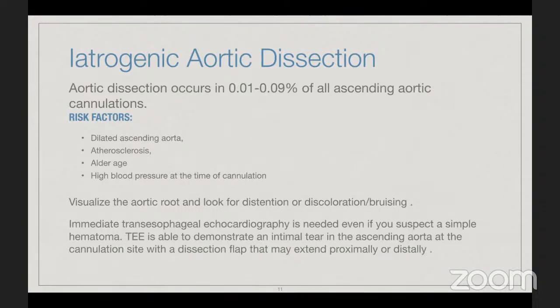And can't I continue the bypass with a low flow after pushing the arterial cannula inside? There is no point of continuing your flow in a dissection because you are not perfusing anything. If your cannula is already in the false lumen, that means it's not in the lumen. False lumen is something outside the circulation.